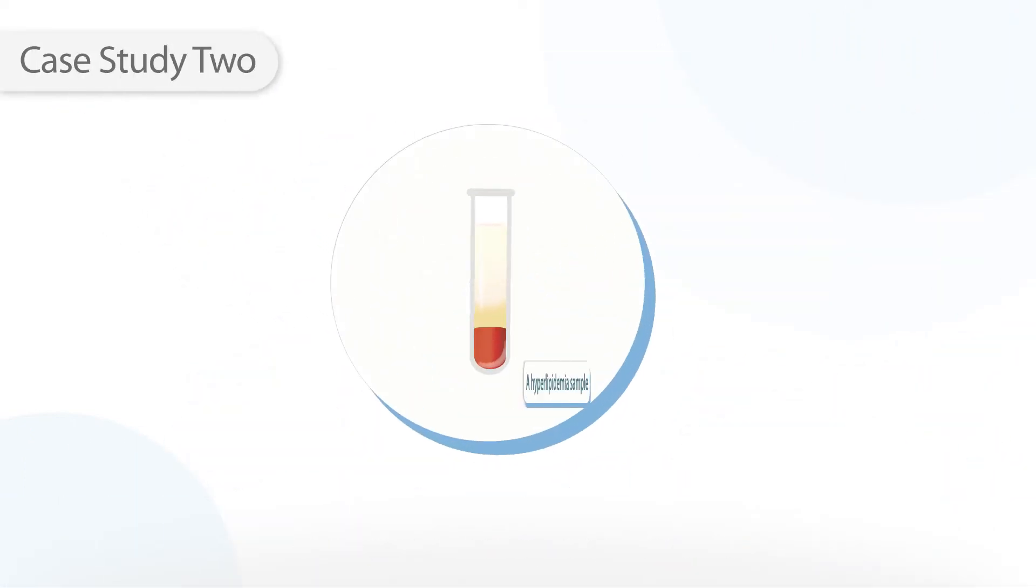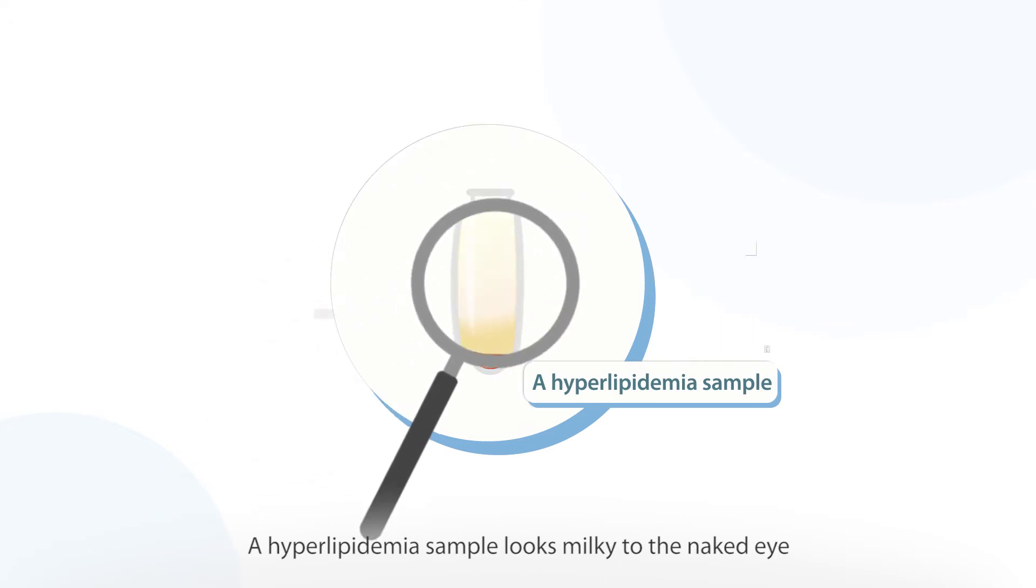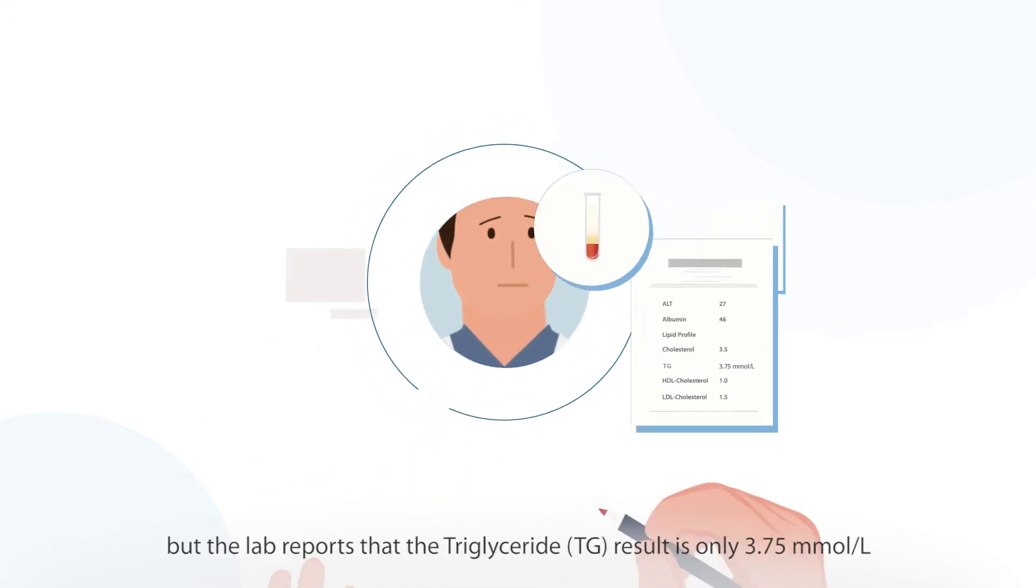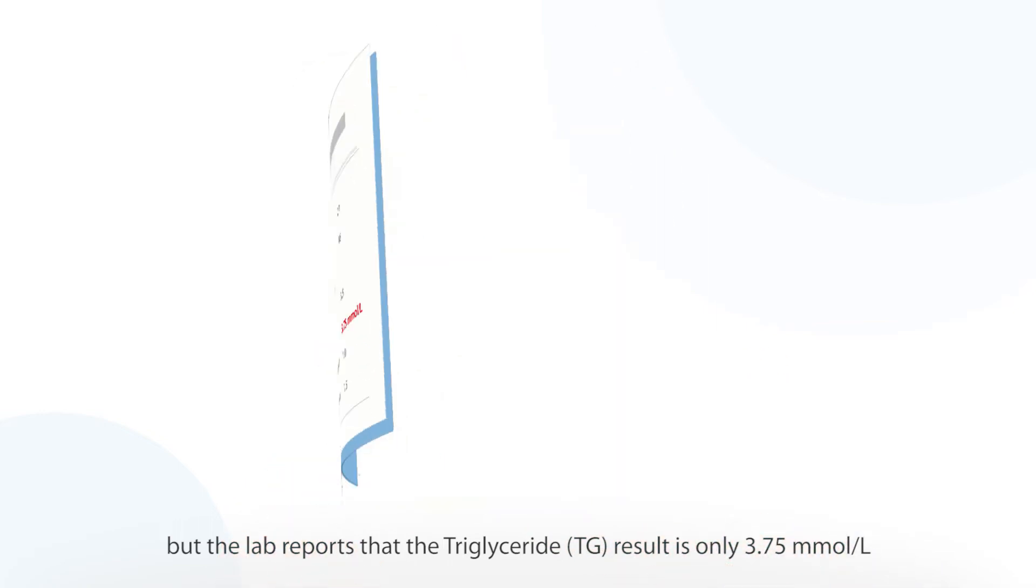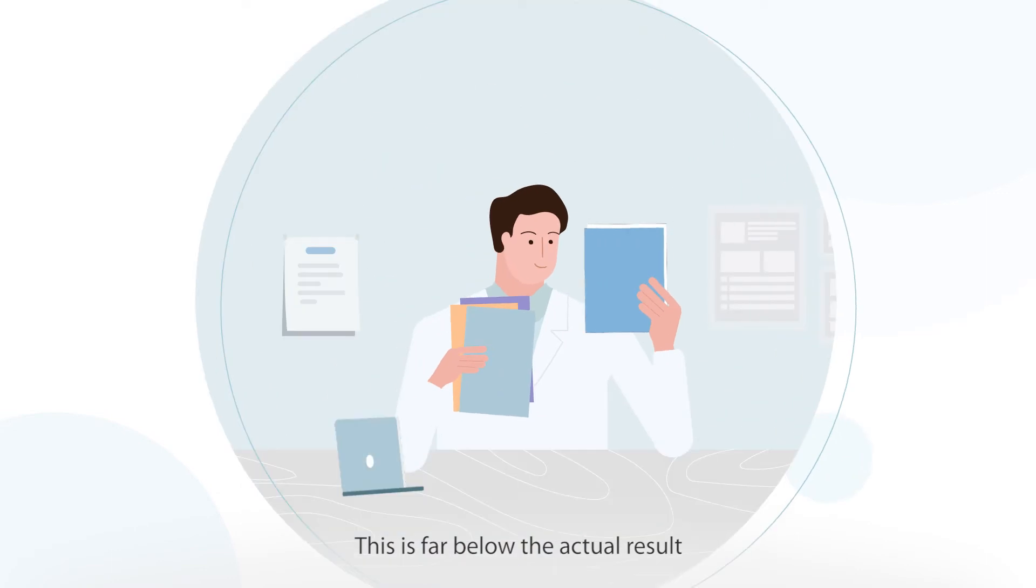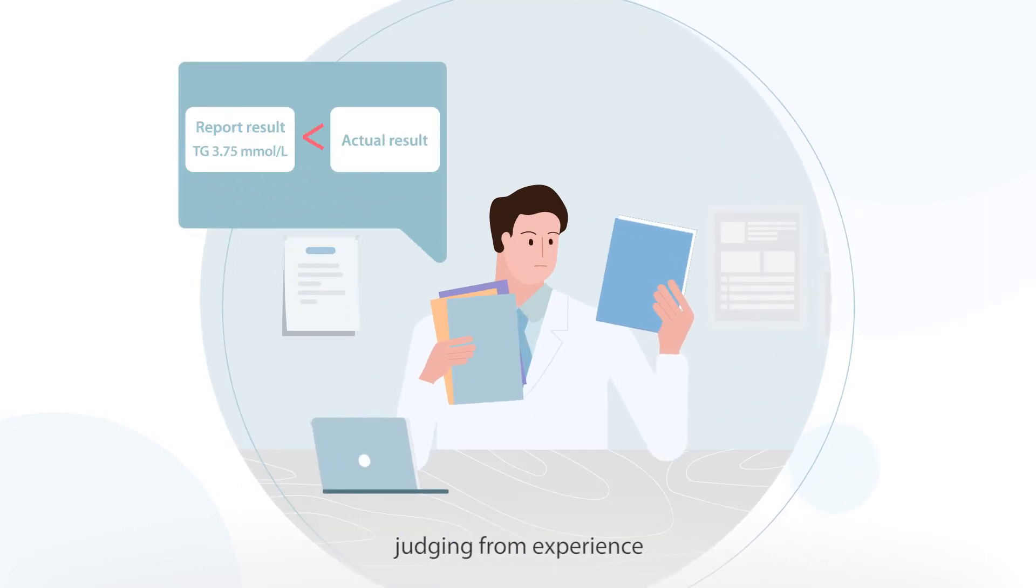Case Study 2: A hyperlipidemia sample looks milky to the naked eye, but the lab reports that the triglyceride result is only 3.75 millimole per liter. This is far below the actual result, judging from experience.